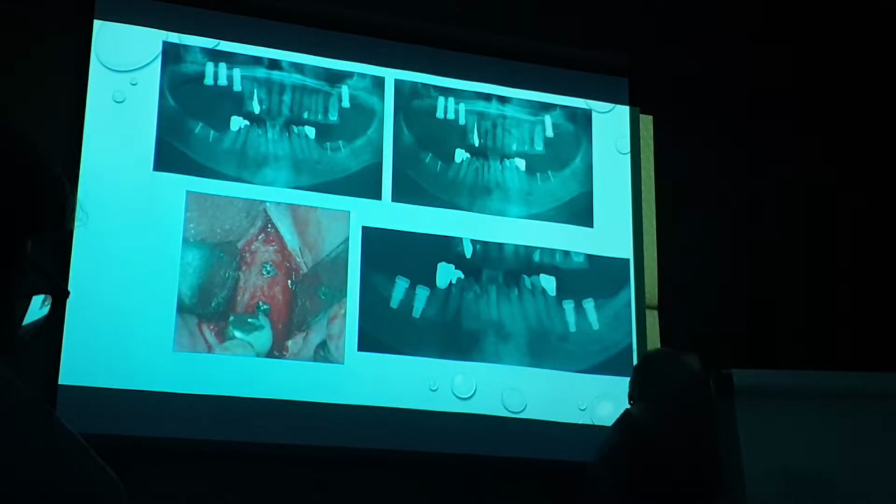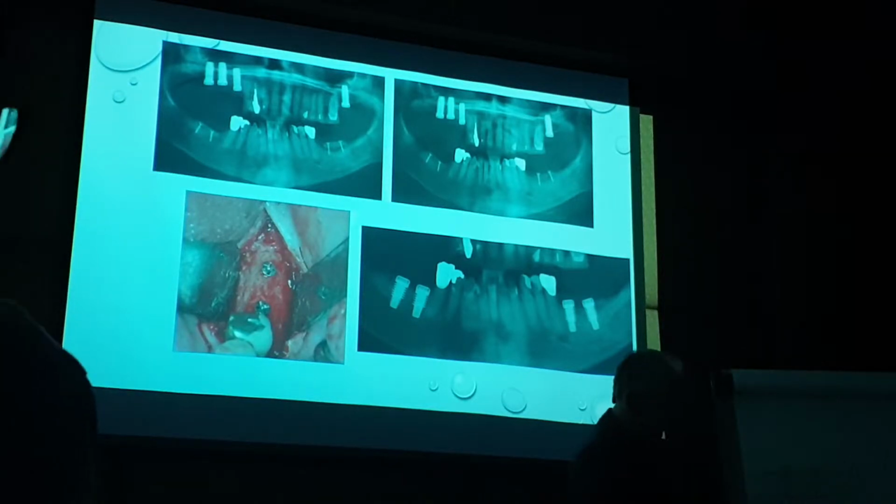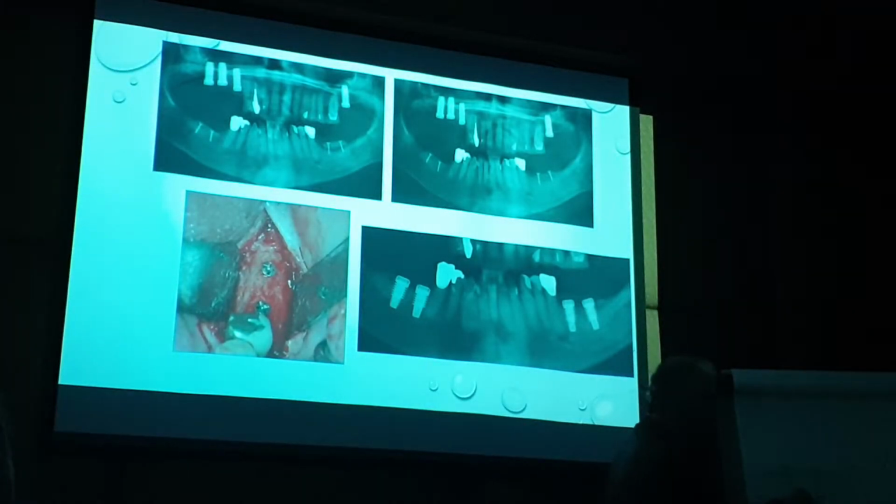But if your defect, let me extend this out now, if your defect now looks like this, I can rest the bone plate on either side of that defect, and it's an easy thing to get them to stay in place. Does that satisfy your question?